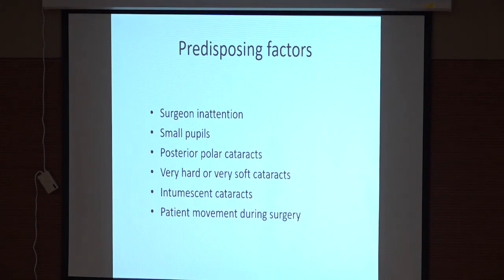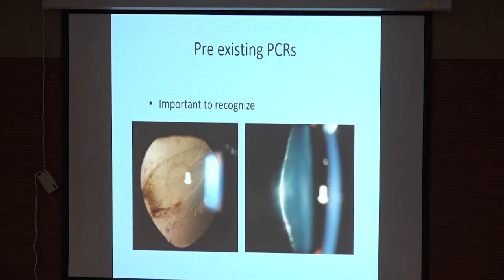When we have these kind of cases, obviously the incidence of intraoperative complications rises. And there may be at times pre-existing PC tears as well, especially when associated with trauma or posterior polar cataracts. So you have to carefully examine these cases to look for a pre-existing opening.